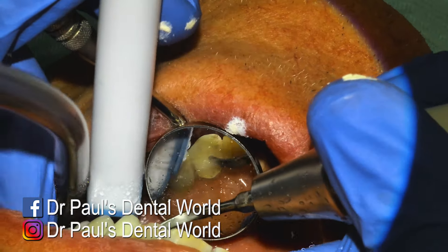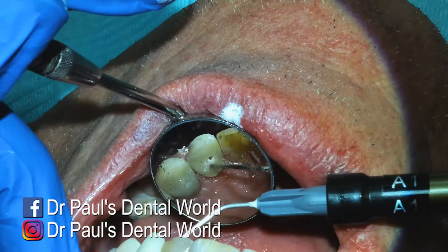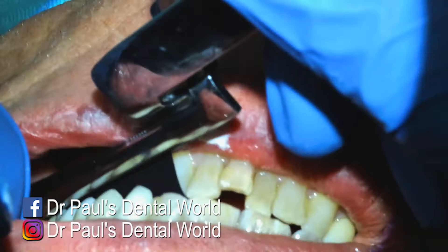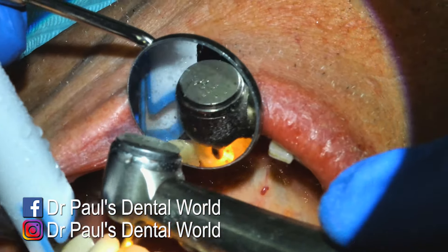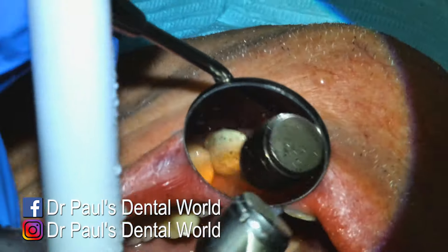So you can leave it in place, or if you clear it out, it then leaves you some space to fill that area with some flowable composite. Or you can use regular composite if you like. After you load that up, you cure it and then you'll check the bite. Often you'll have to adjust a little bit where you added that flow. And I'll do any further smoothing that I need to. And then at this point, I'll finish off with my ultrasonic around the margins just to make sure that they're all nice and clean.